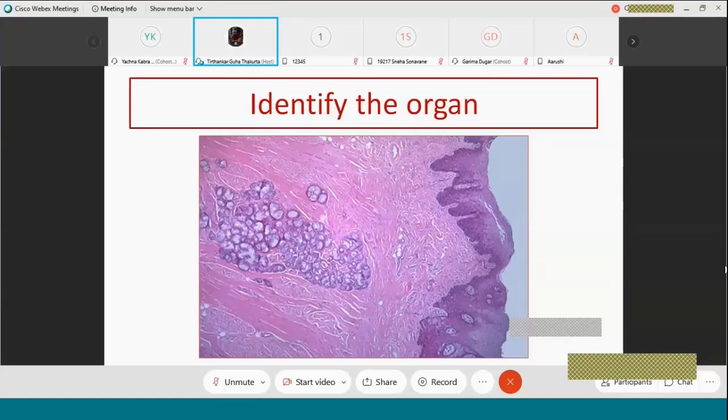So the same principle applies in histology and histopathology. Diagnosis must be made in the low power. Confirmation may be done in the high power. But if you try to diagnose in the high power, most of the time you will not be able to diagnose. So this is one trick that you should keep in mind. Let us quickly revise through this portion, and then once this is done, we'll start with the pathology portion, histopathology.